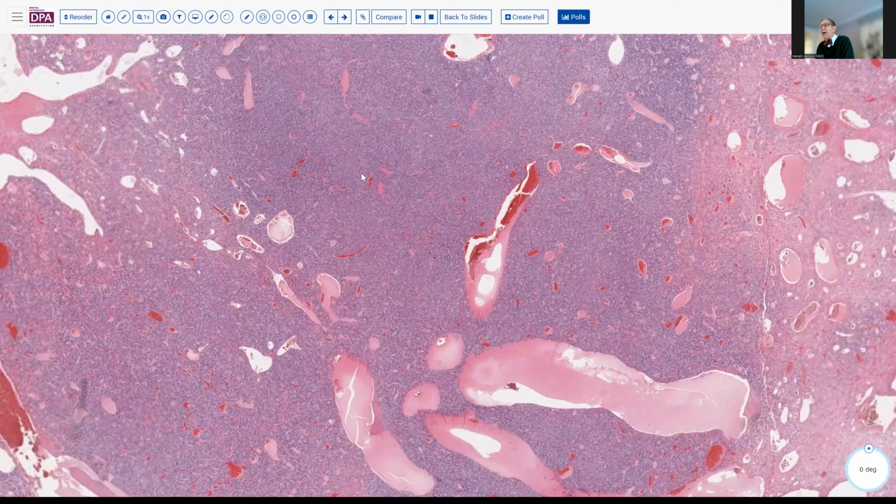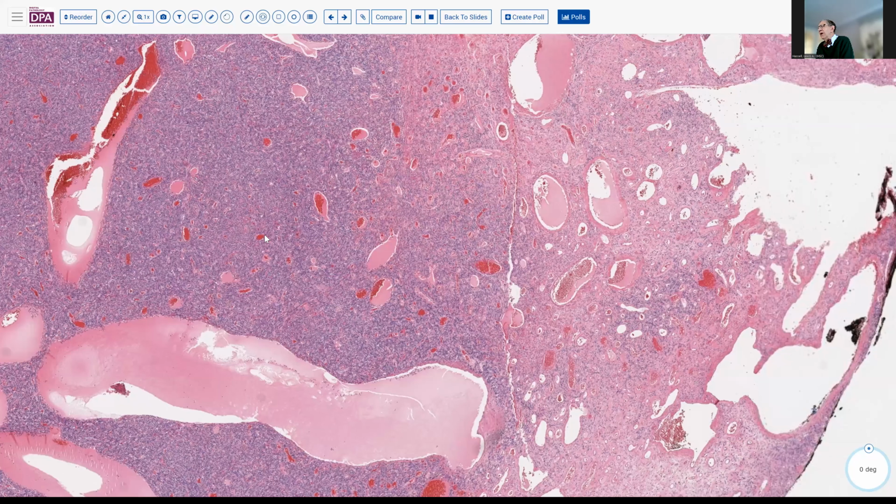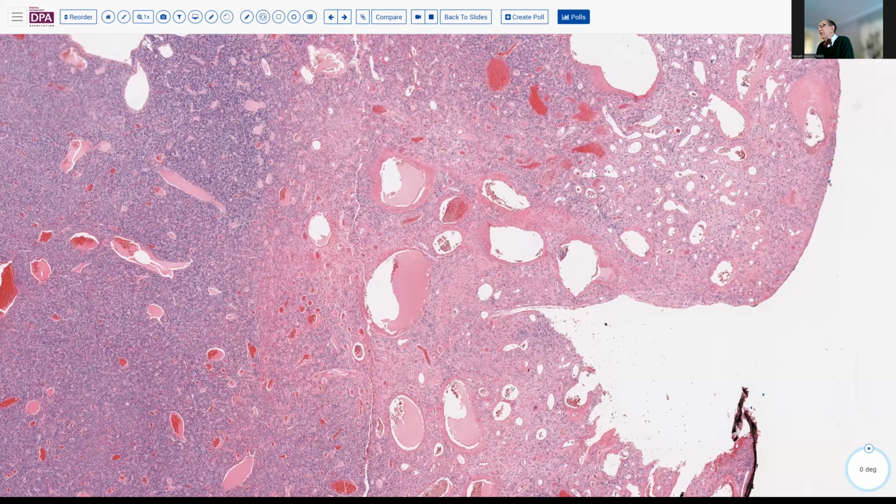And as you can see, we have a lot of vascular spaces. They're very dilated here, and sort of ectatic. Some people sometimes refer to them as staghorn. I don't see these as being angulated in quite that fashion, but they're certainly a very prominent feature. And then in areas here, you see how it becomes somewhat collagenized with just the vessels remaining.